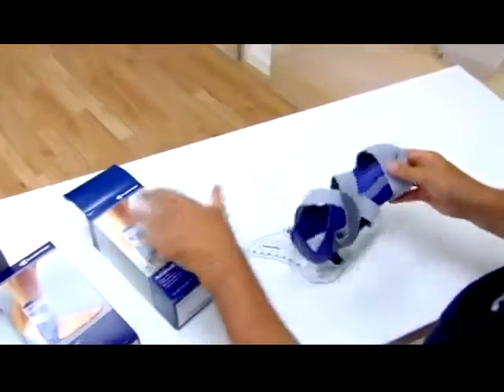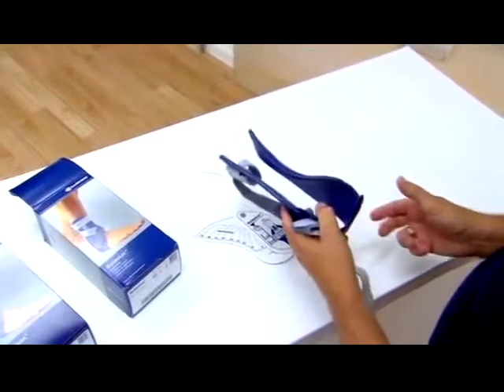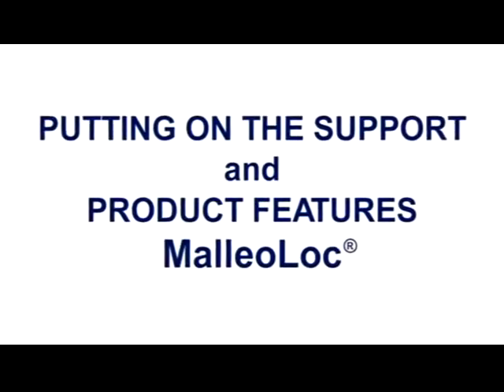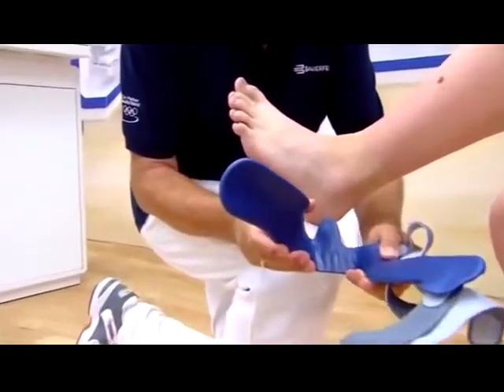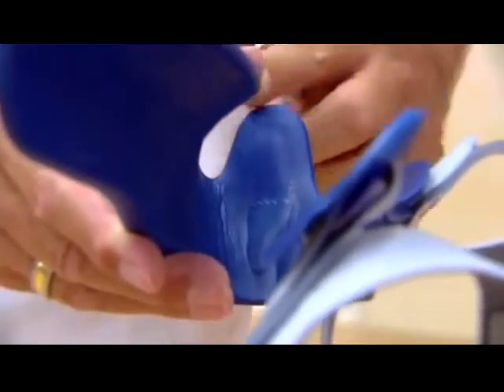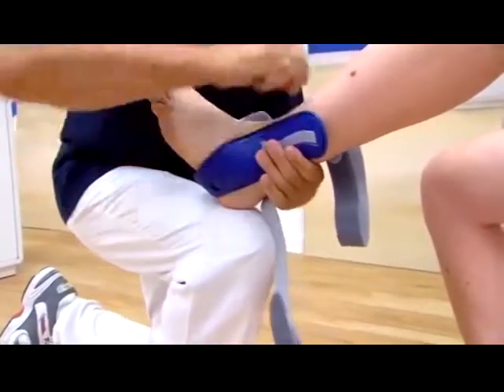First of all, the Malleolock is put on with the help of an orthotist or trained specialist. Open the two adjustable stabilizing straps completely. The left-right version is indicated by a corresponding foot symbol on the inside of the orthosis. The tongue-like protrusion on the shell points forward toward the toes. Ensure that the outer shell is positioned in front of the ankle mortise and the inner shell is behind the ankle joint.